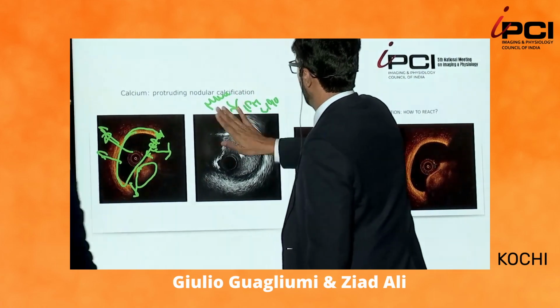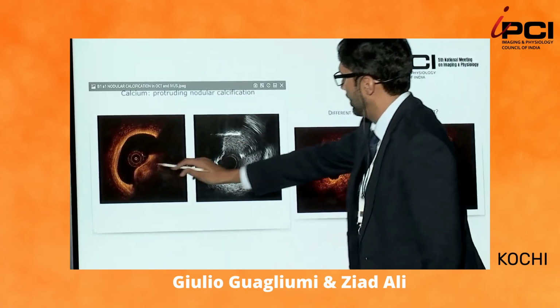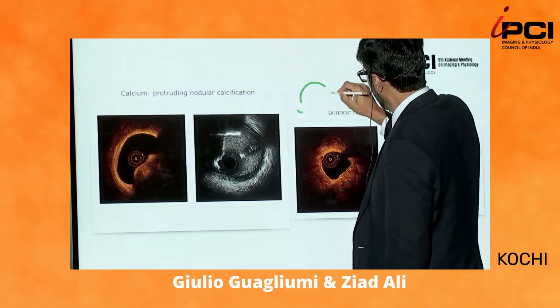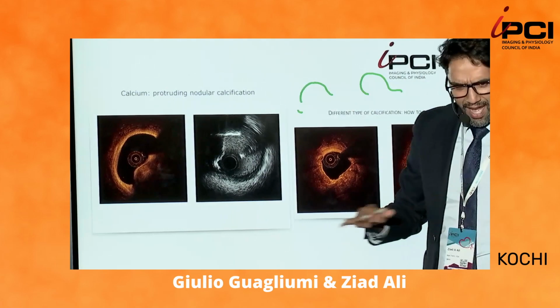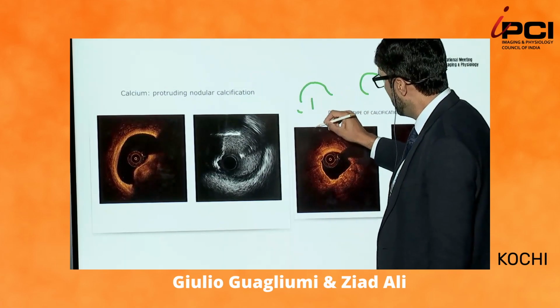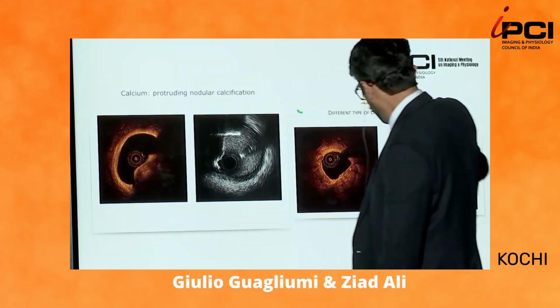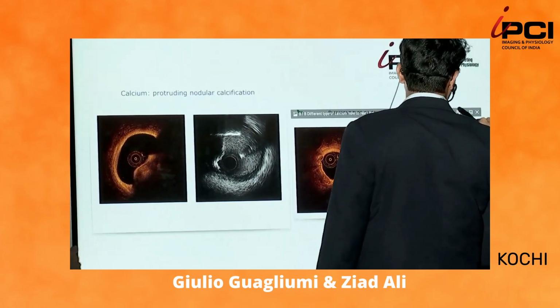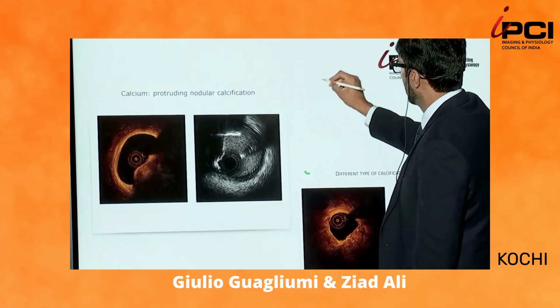All right. So here is the bottom line, guys. There are two types of marbles. Okay? Unfortunately, you cannot see underneath the marble with intravascular imaging. There is a marble. Where can I do it? Here. Wonderful. Okay, good. Thank you. Okay, there's two types of marbles.